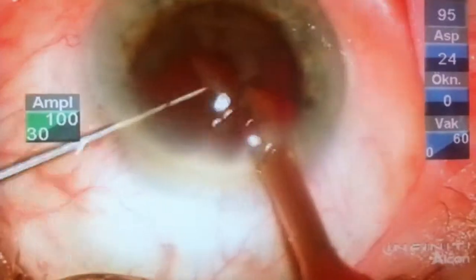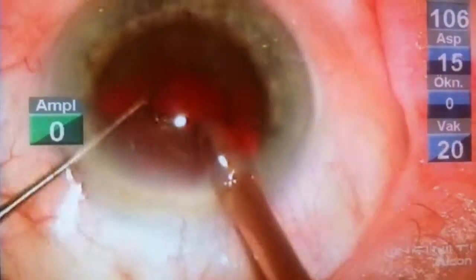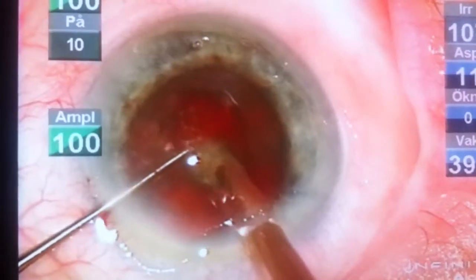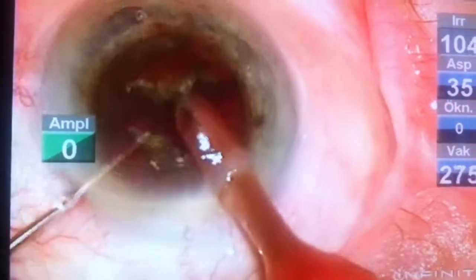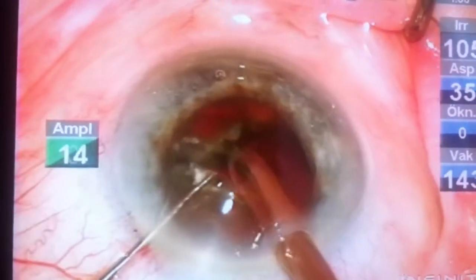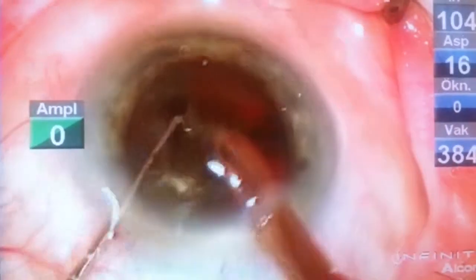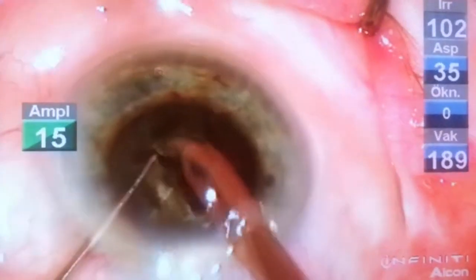I prefer always to start with the vertical chop to divide the nucleus into at least four pieces. The first step is to embed the phaco tip within the nucleus, maintain good stability of the nucleus, and make the first vertical chop using the philosophy of Dr. Vasavada with lateral separation in situ — putting the two instruments within the groove and separating them carefully.